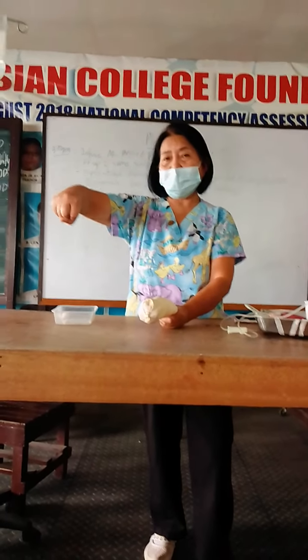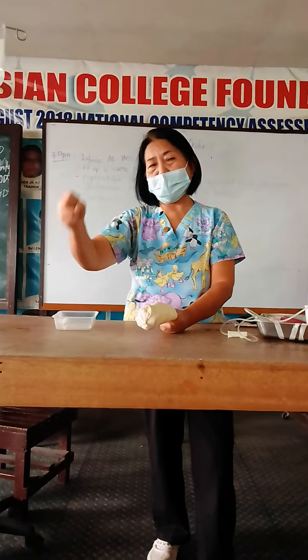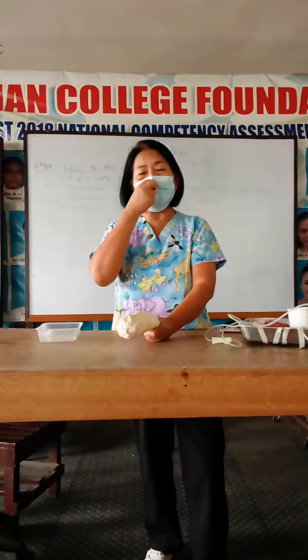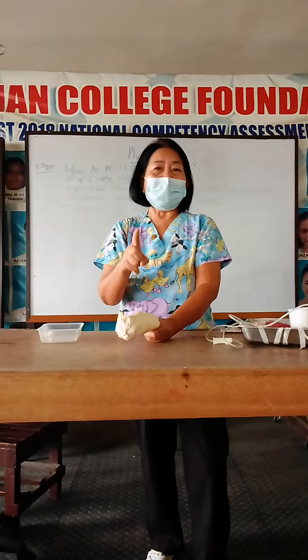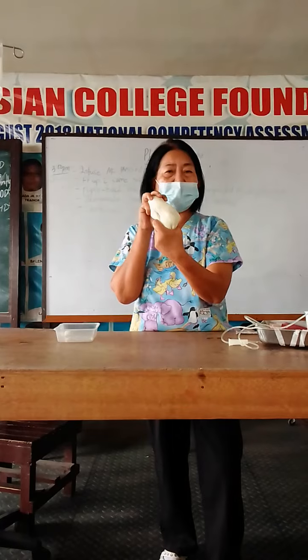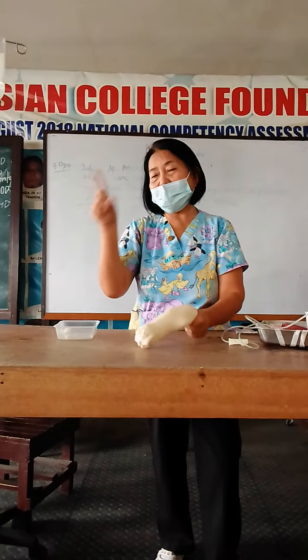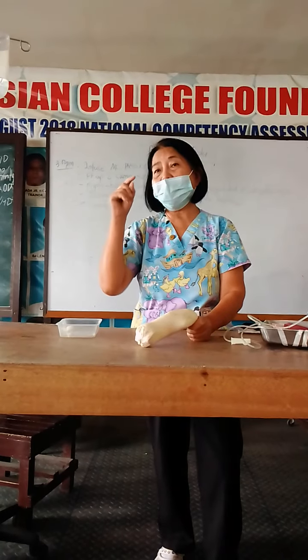Make a fist like that. In order that, aside from the tourniquet keeping the vein stable or avoiding movement, the technique also of making a fist and the way you hold the patient's hand will also stabilize the vein so it does not move around.